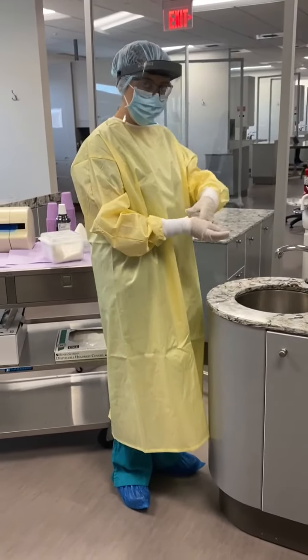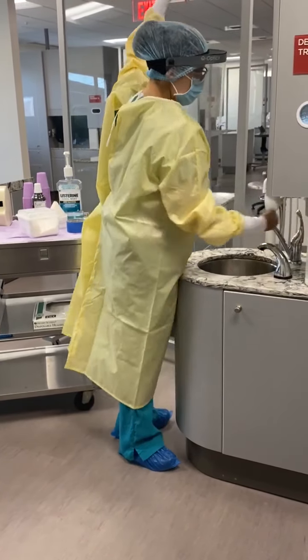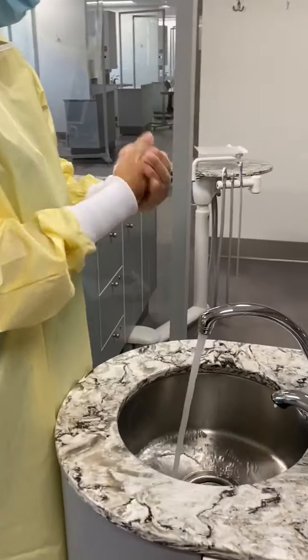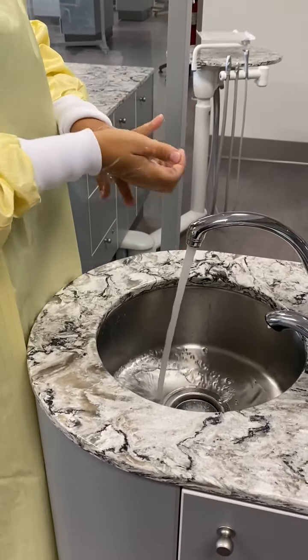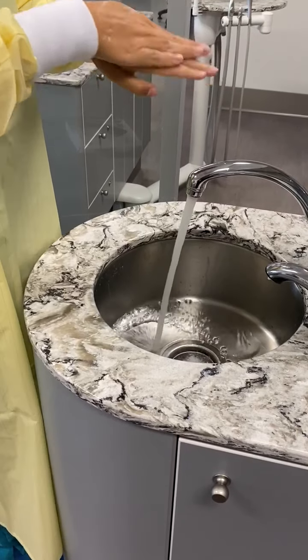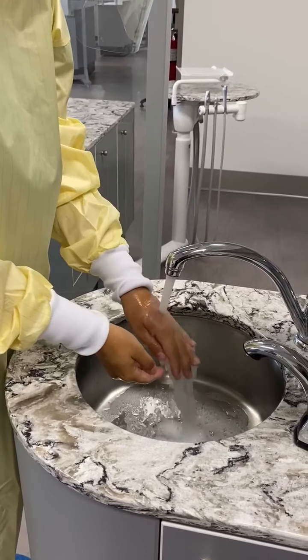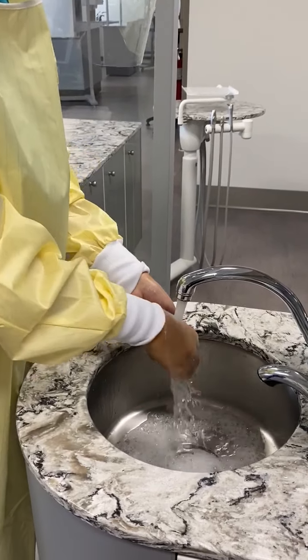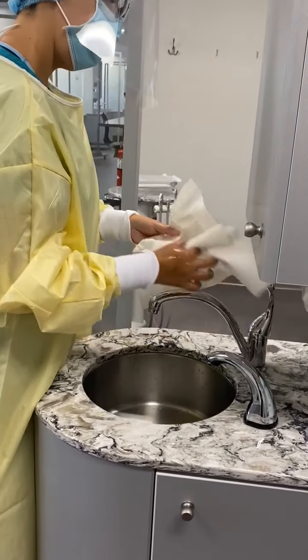At this point, you will now remove your gloves and perform hand hygiene protocol. Once you have washed your hands and let them dry, you will don a new pair of exam gloves.